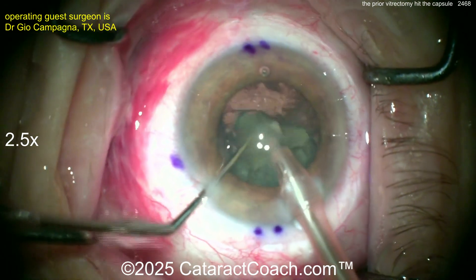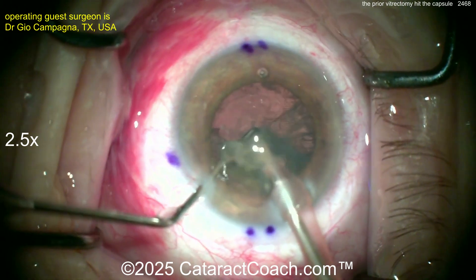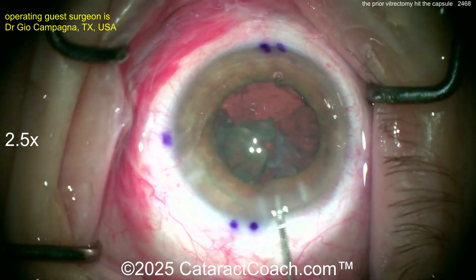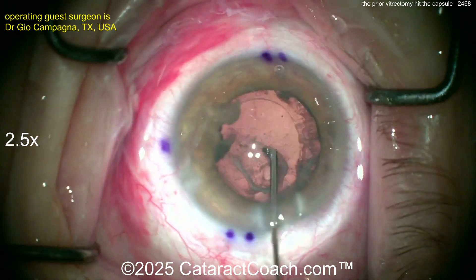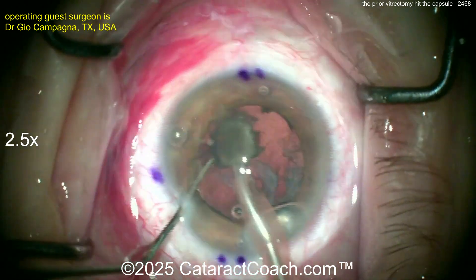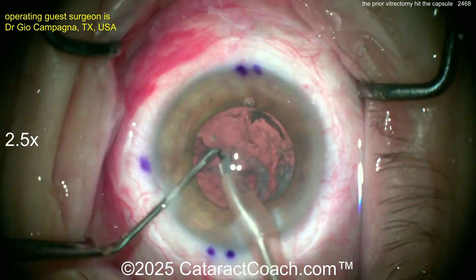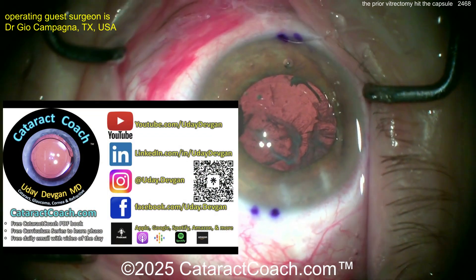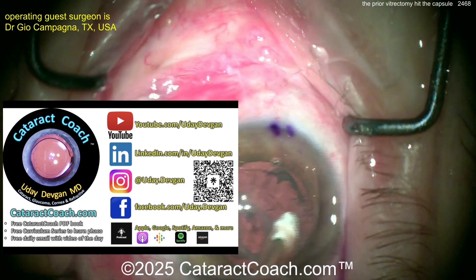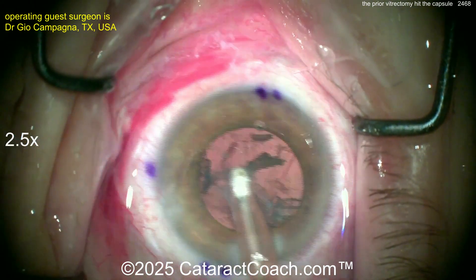As you know, in a prior vitrectomy eye you've got to be very cautious because you don't have any support — like the anterior hyaloid face — supporting the back of the posterior capsule. Now, injecting viscoelastic — I like that. Have the viscoelastic as your sacrificial barrier there and just get that last nuclear piece out. Chopper in good position. Looks good. Remember, check out our podcast — top podcasts on all of ophthalmology. You're going to learn how to be a more successful surgeon. Back to our case here.